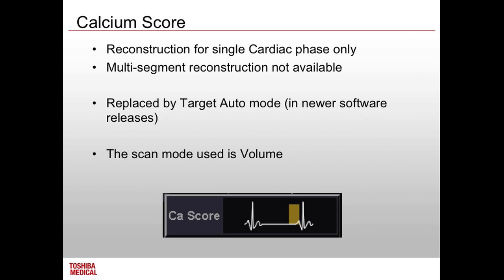The important thing to remember with calcium score is, for you guys, again, it's easy because you do it in one rotation, but you have to do it in one breath hold. Calcium scores can actually have a longer breath hold than the coronary scan, and that's just because of the way it scans. It's like a step and shoot technology.